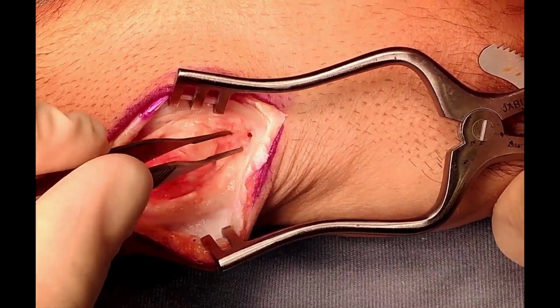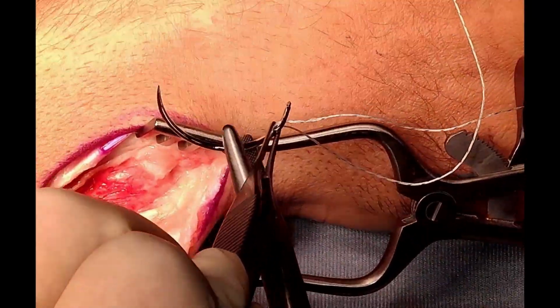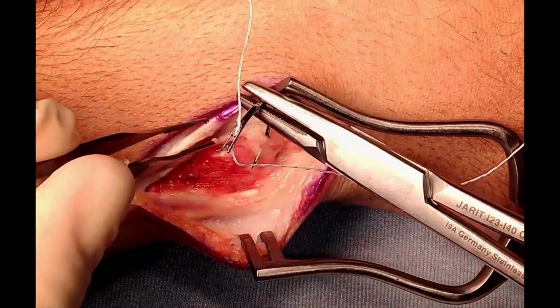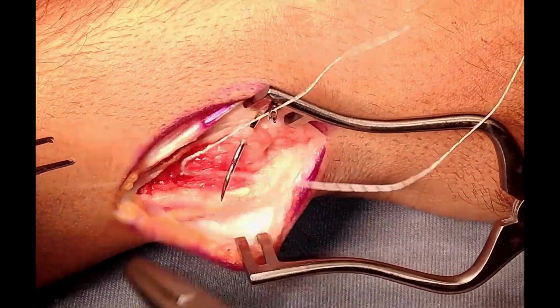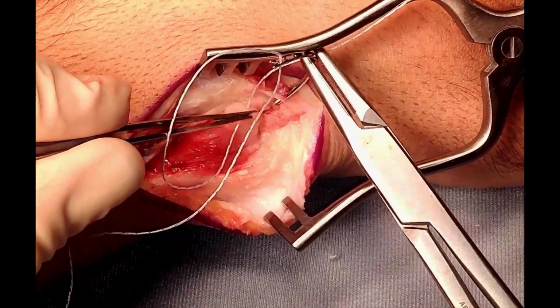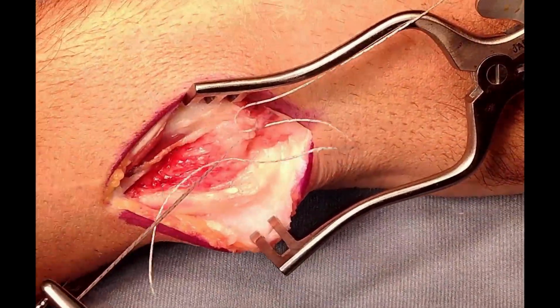and for that we will need a fiber wire that we will put in the ligament, whip stitch it. We will have double threads in order to use a knotless anchor for this mission.